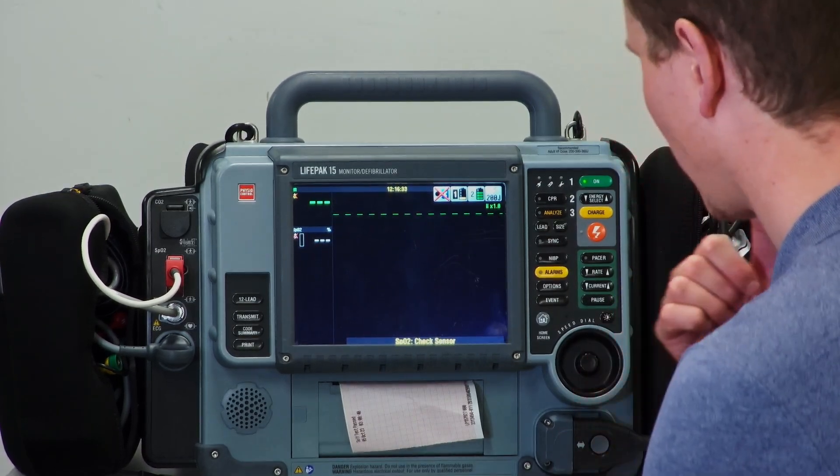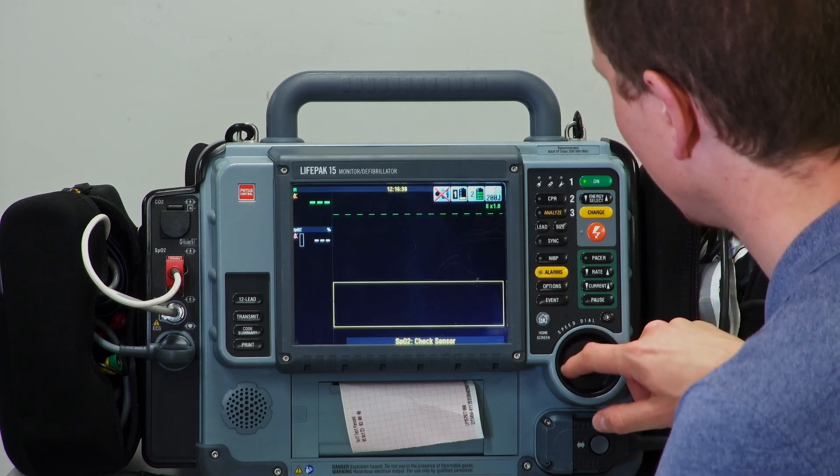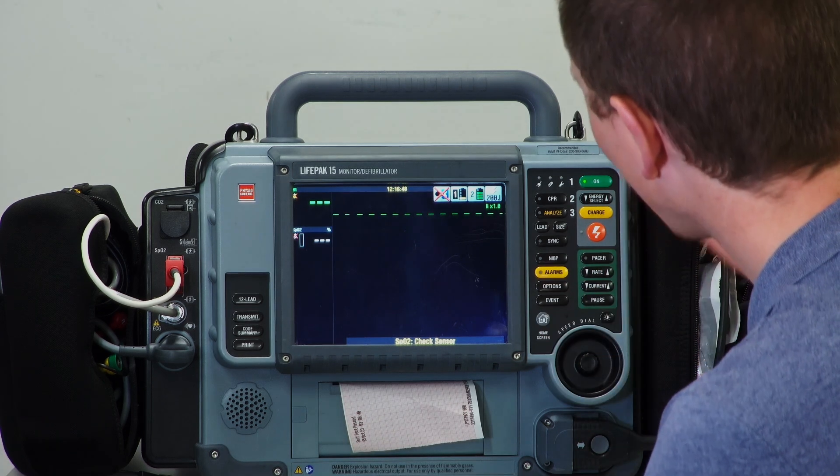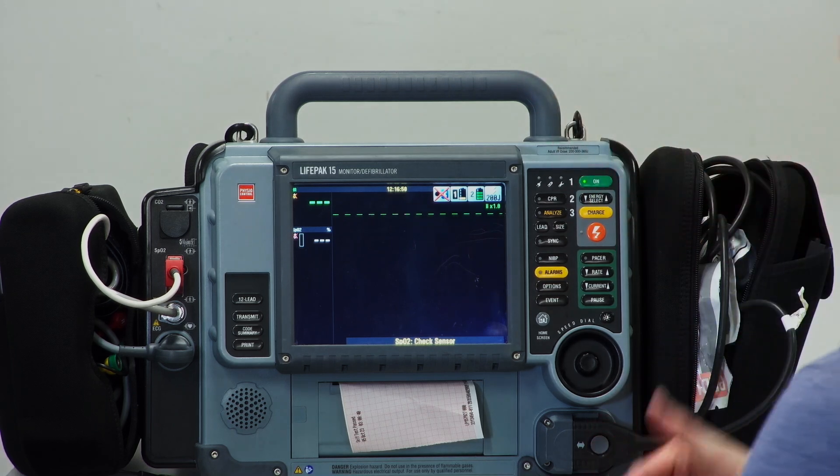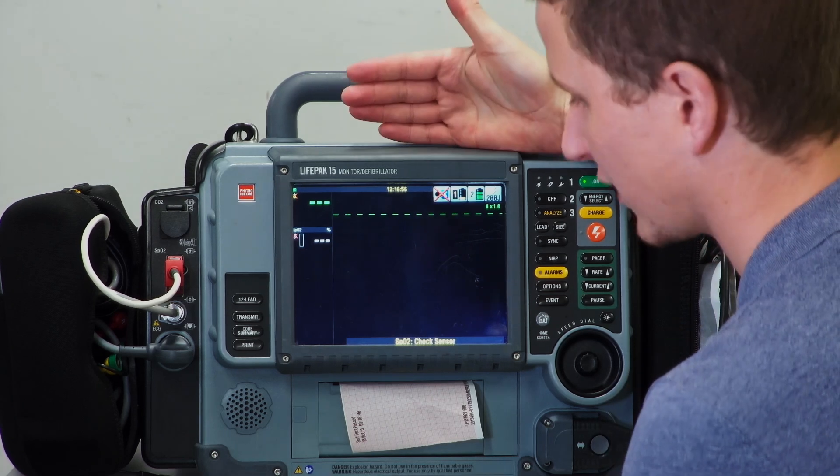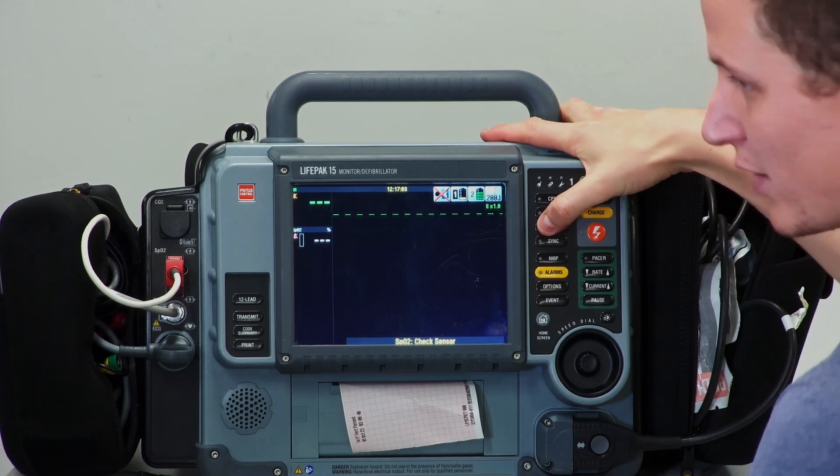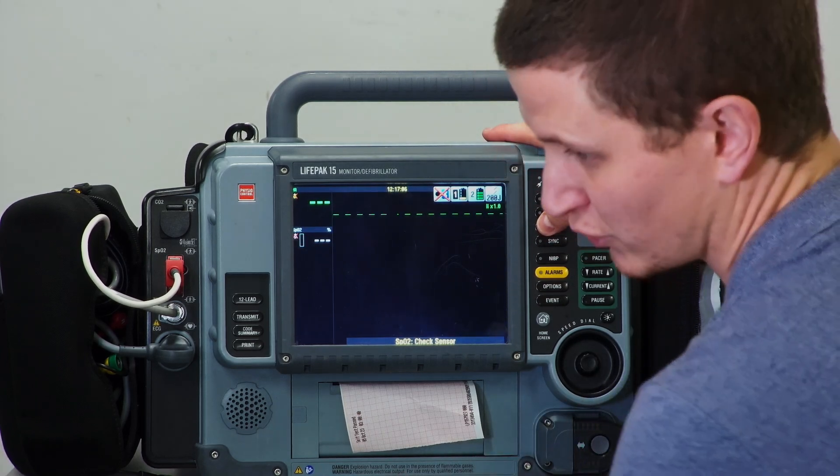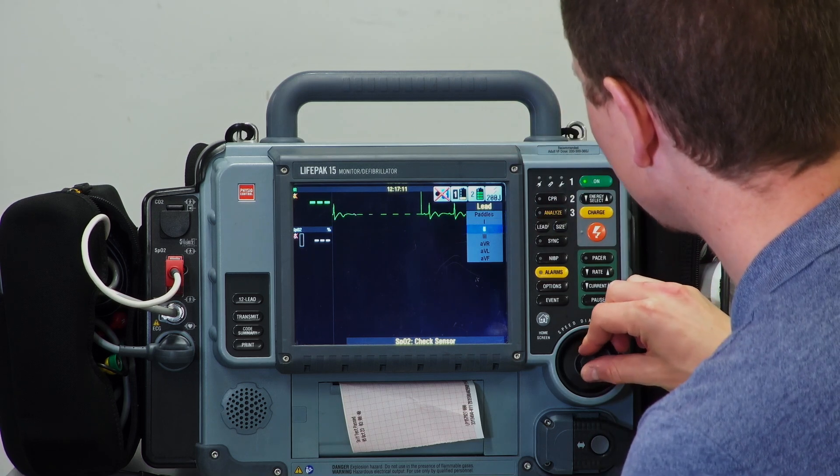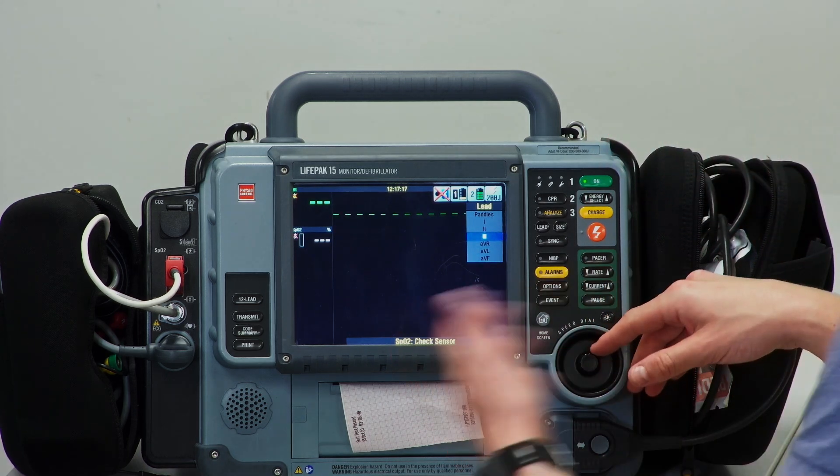A touchscreen would just break quite easily, so to control it and select things you have to turn this dial. You can push the dial in to select and rotate. If you want to cancel your selection, just hit the home button. I've plugged the machine into a rhythm generator so I can control what rhythms are popping up. We're not seeing a rhythm because we have the wrong lead selected. On a typical three or four lead ECG we have lead one, two, three, AVR, AVL, and AVF.